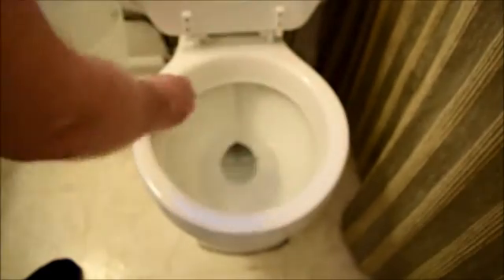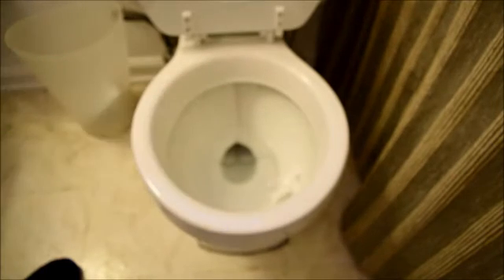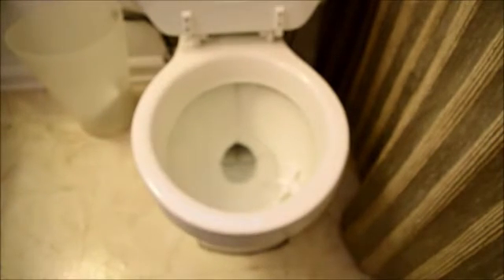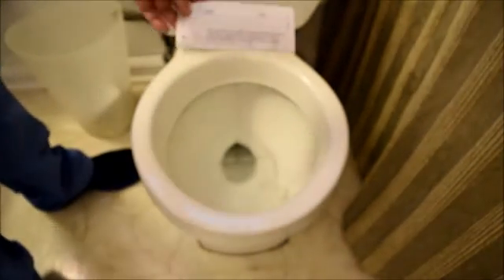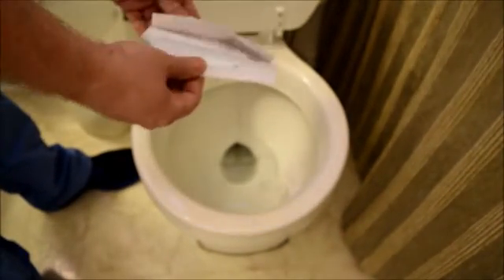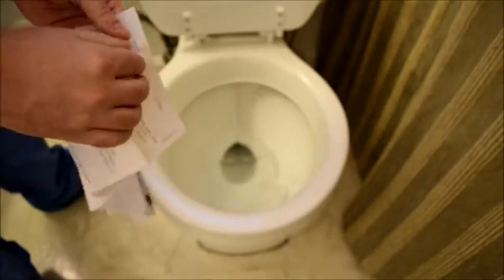The first thing you're going to do is to enter your restroom, lift the toilet seat up, go ahead and take some tissue and make sure that the rim of your toilet bowl is clean and dry. You can throw the tissue into the toilet, it's not going to harm the test. Next, you're going to take one of the flushable tissue papers that was provided to you. This tissue paper has adhesive strips on both sides, so you're going to take off the backing for the adhesive strip.